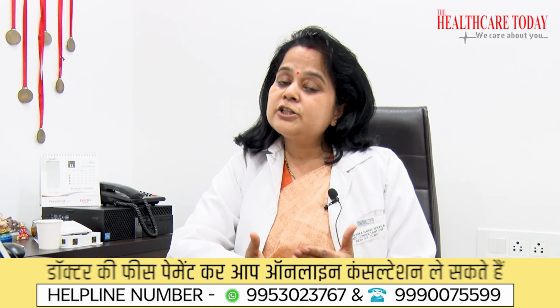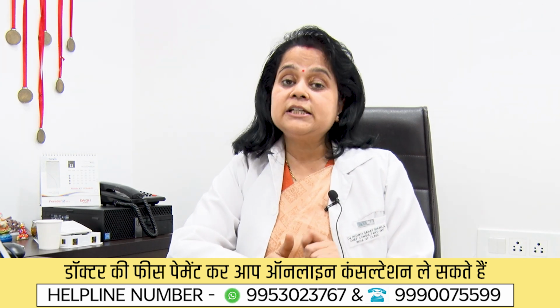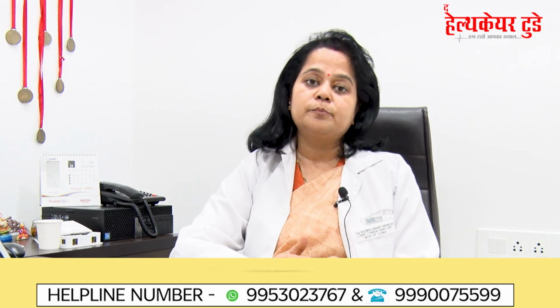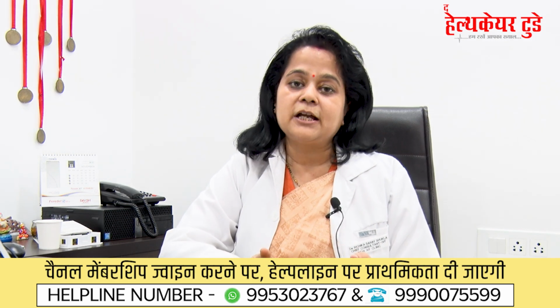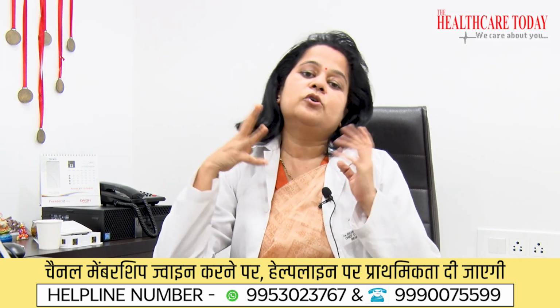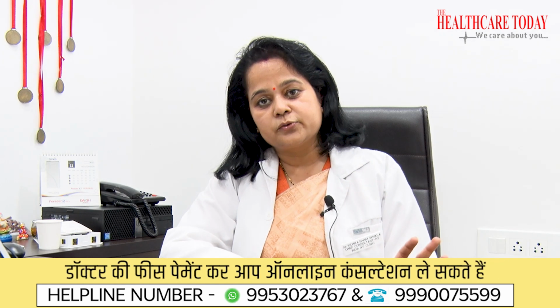Thirdly, even if there is no visible problem, we can do an endometrial biopsy, take the sample, and send it for further diagnosis to find out why you are having this recurrent implantation failure or recurrent abortions. But nothing is 100% because it is medical science. But obviously that will take us more towards the diagnosis.